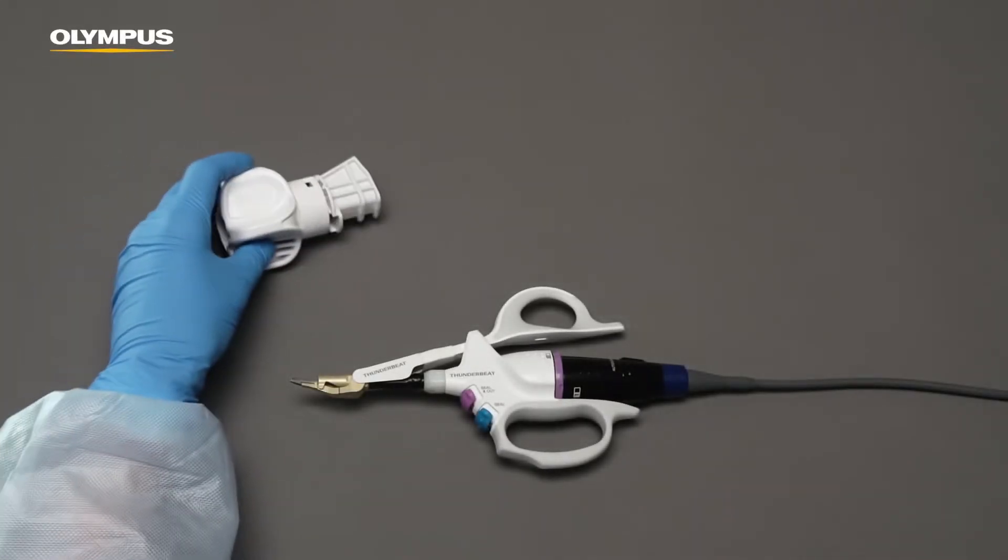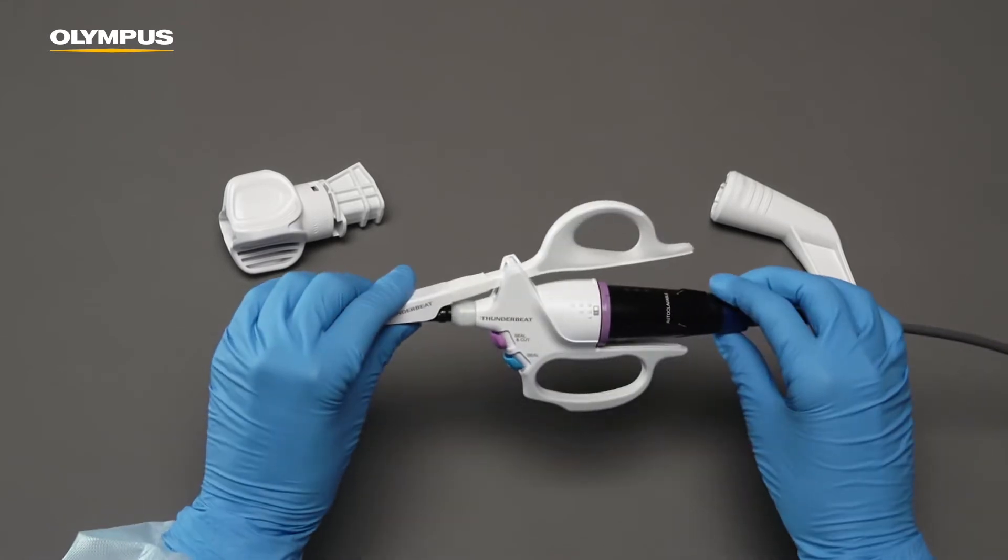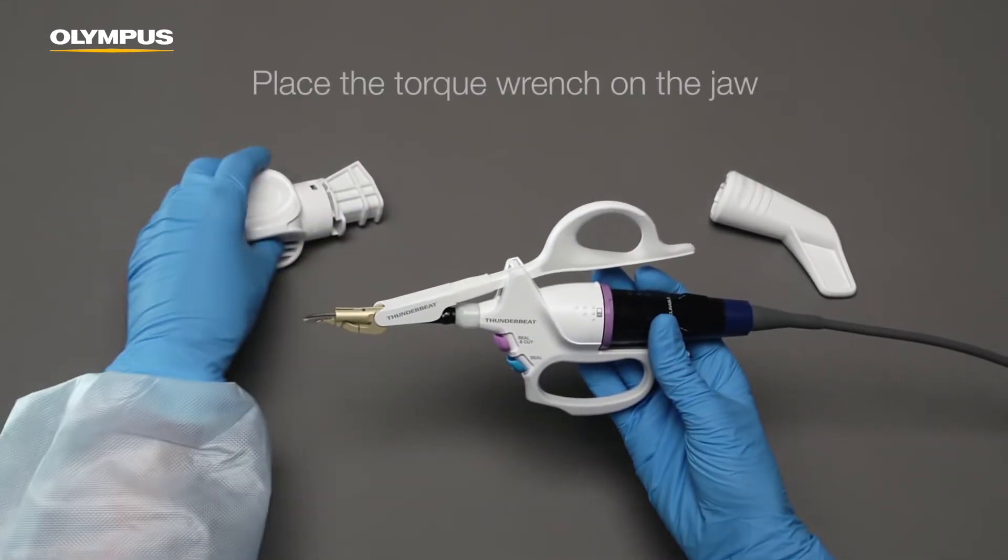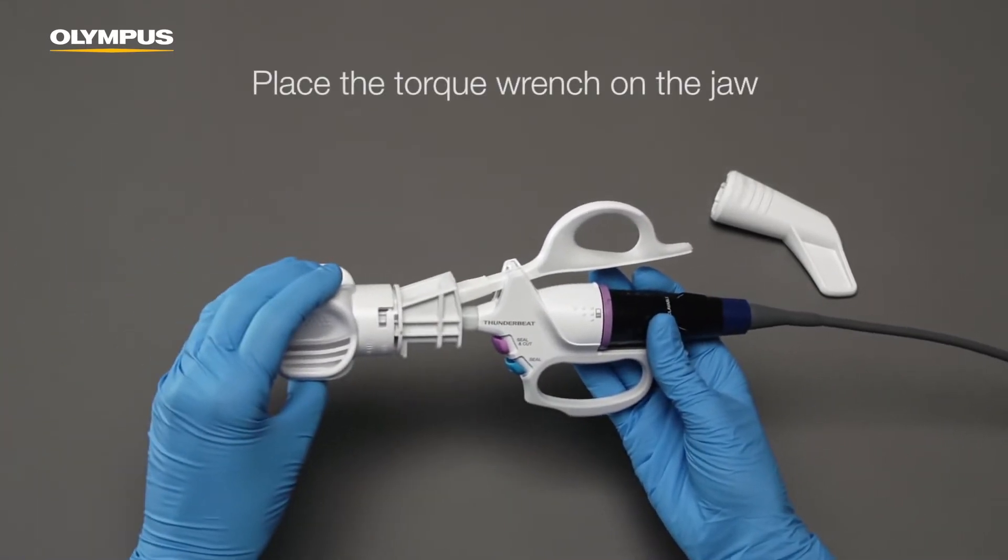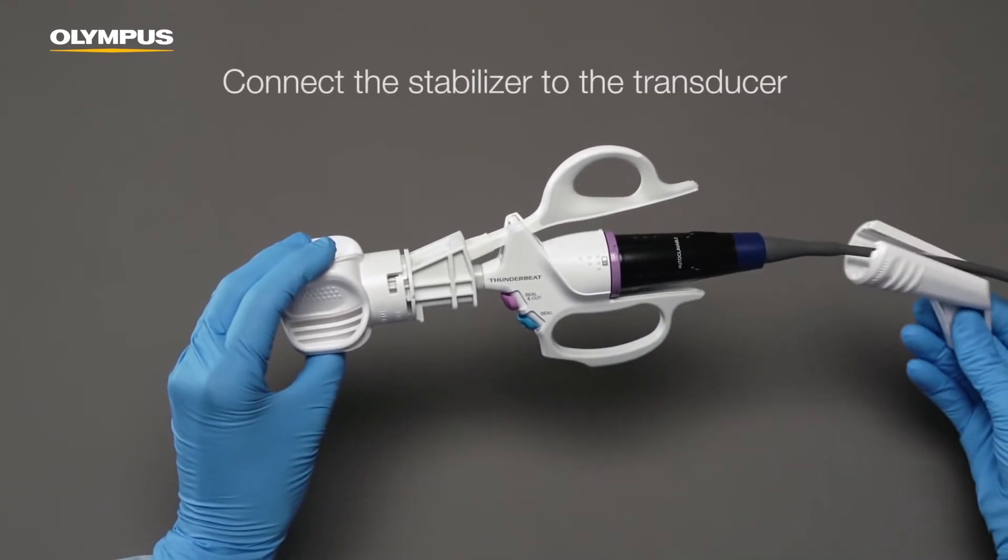For disassembly, you will need both the torque wrench and the stabilizer. Place the torque wrench on the jaw and connect the stabilizer to the transducer.